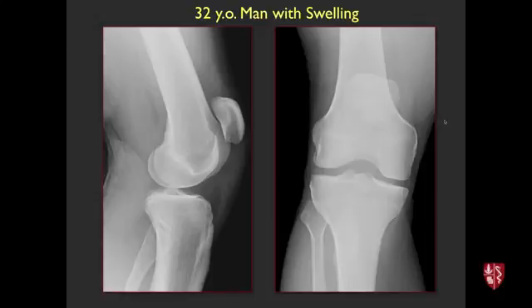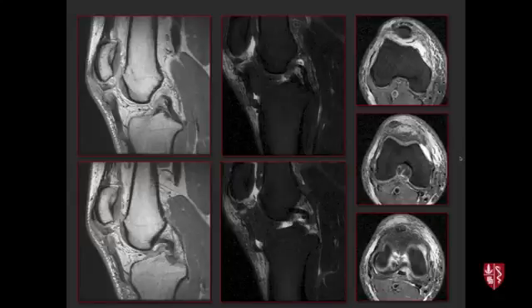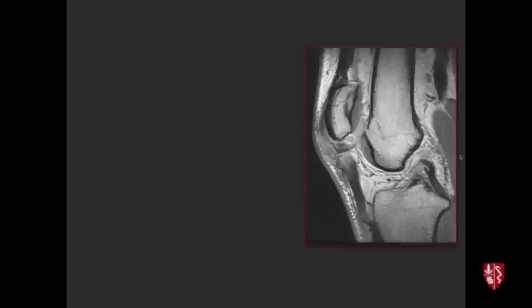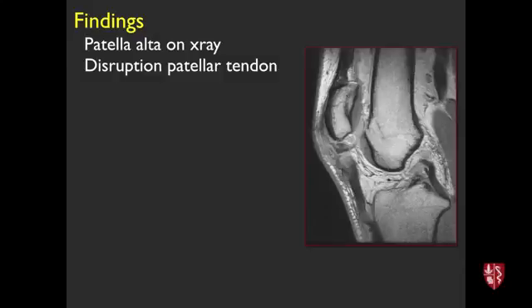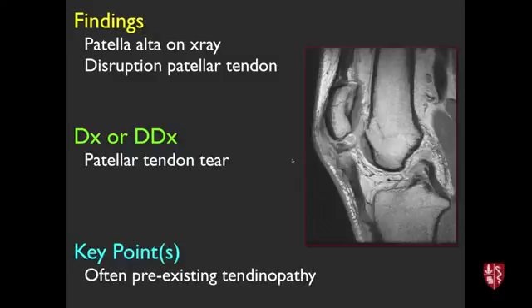Next case, 32-year-old man with knee swelling. On x-ray there is patella alta — the patella is too high. On MRI there's disruption of the patellar tendon at the proximal portion with the patella elevated — a high-grade, likely complete patellar tendon tear. These tend to occur in patients with pre-existing proximal patellar tendinopathy (jumper's knee) unless there is a high-energy injury.